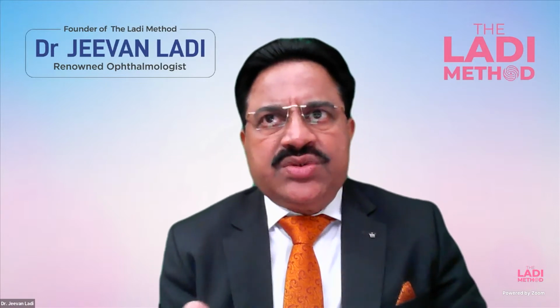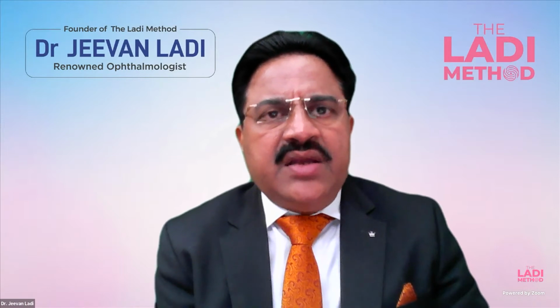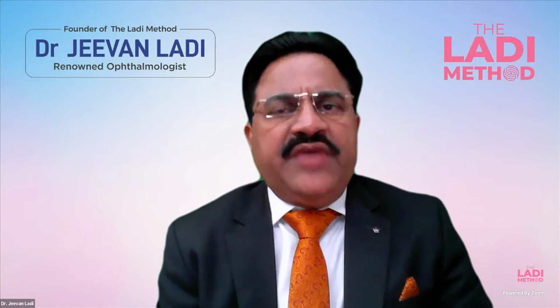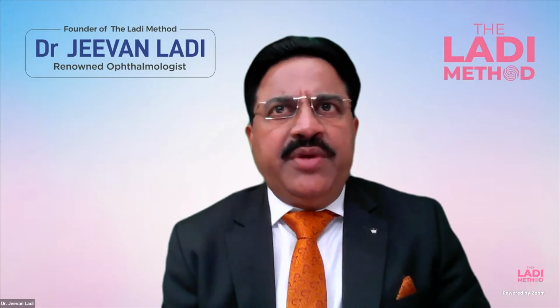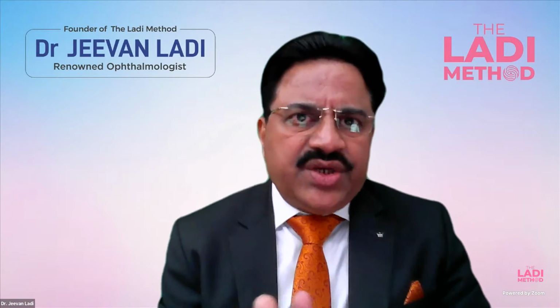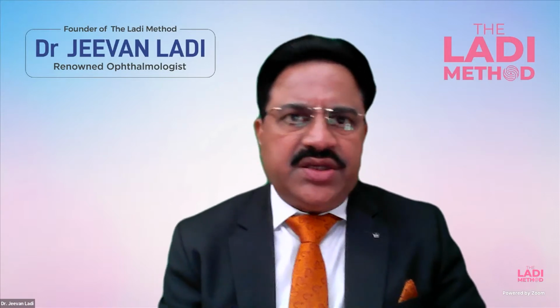But at least it gives you an idea whether they are out of bounds. Posterior corneal astigmatism throughout your lifetime remains anywhere between minus 0.3 to minus 0.7 on average. Of course, it can differ a little bit on either side.